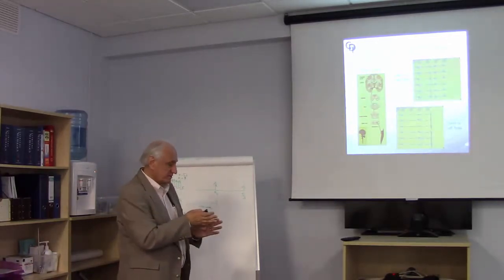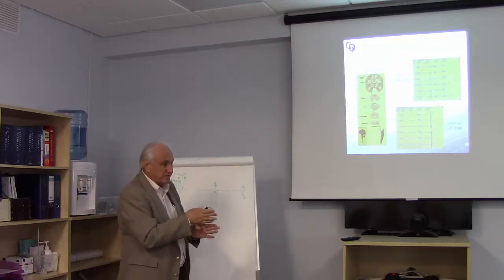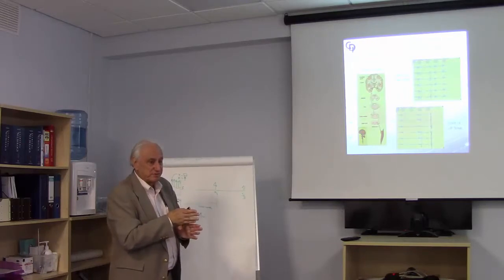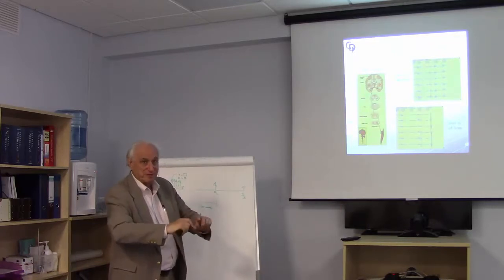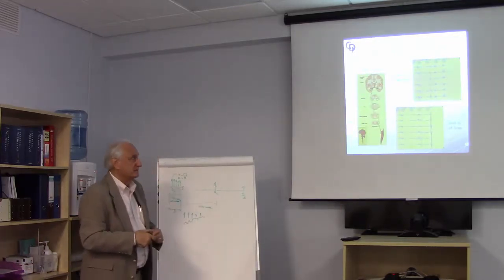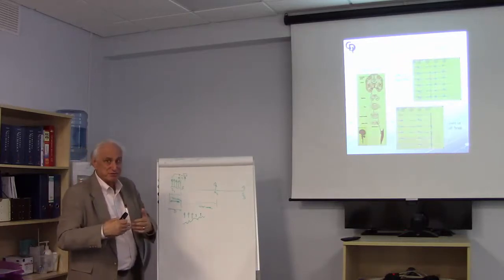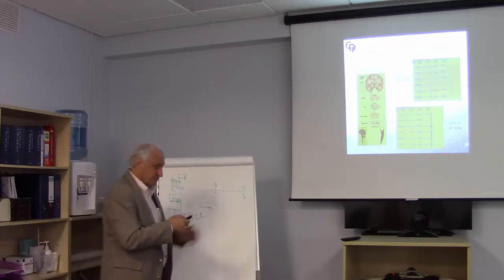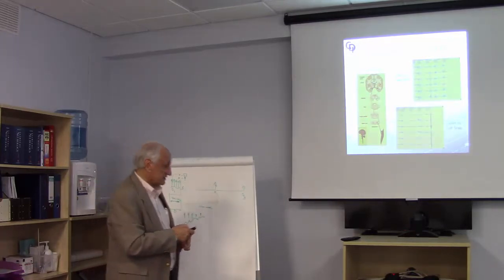What we can do is stimulate the right side, then flip automatically and stimulate the left side. So when you look at the data, it appears as if you're stimulating both sides simultaneously, but we actually put in pairs of electrodes and flip them back and forth automatically. So it looks like you're doing everything simultaneously when in fact you're not. There's a time delay between it. So is this clear? This is a very important point, this anodal stimulation concept.